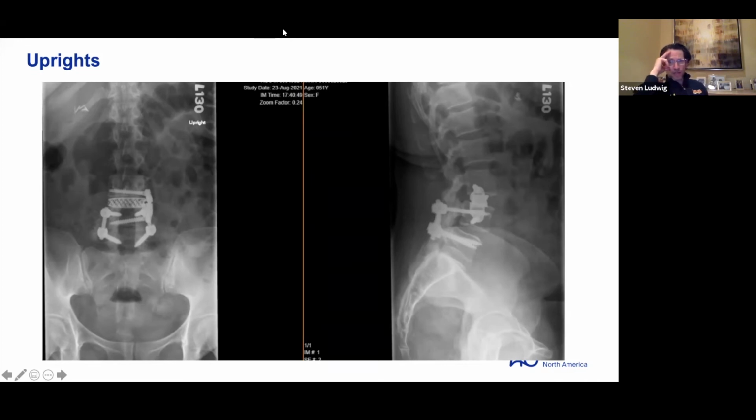So in the face of non-osteoporotic bone, in the face of normal bone quality, for lateral interbody fusion, with the exception of lateral bending, I believe, and rotation, the mechanics are fairly equivalent. It's almost irrelevant if you're at L1-2 or 2-3, but it becomes more relevant as you go down the spine and those motion segments become more important with regards to your range of motion.